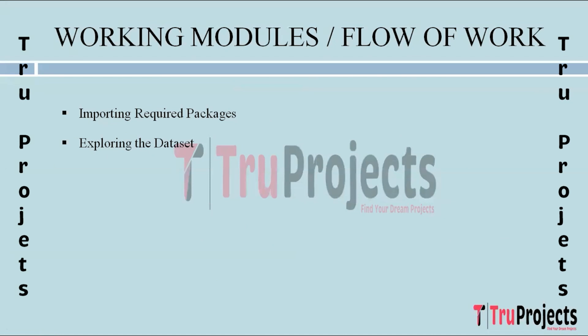The second step is exploring the dataset. So, with a focus on the dataset, we delve into a multi-class MRI Alzheimer's disease dataset. Additionally, we transform it into a binary MRI AD dataset to simplify the classification task. Understanding and preparing the dataset is a crucial foundation for model training.